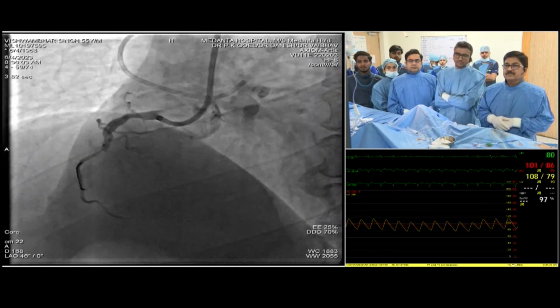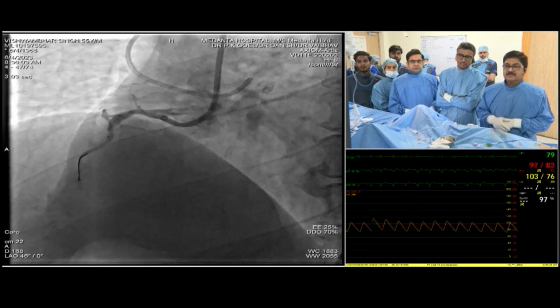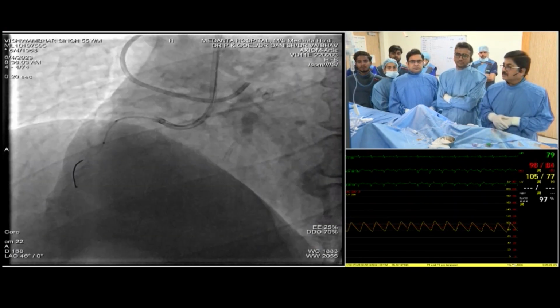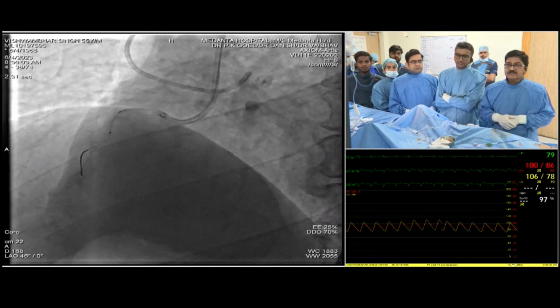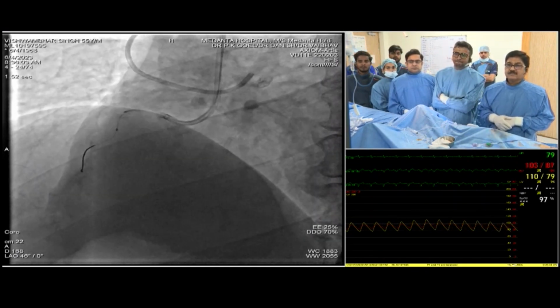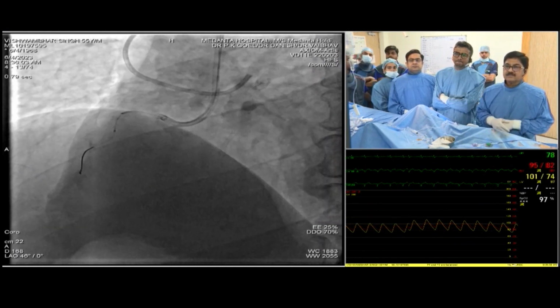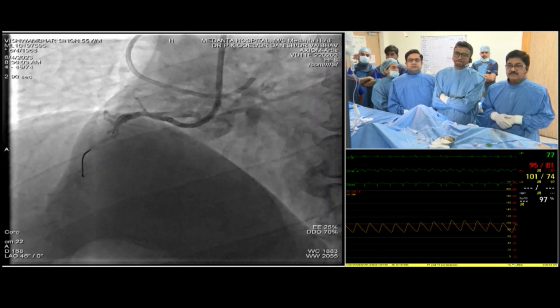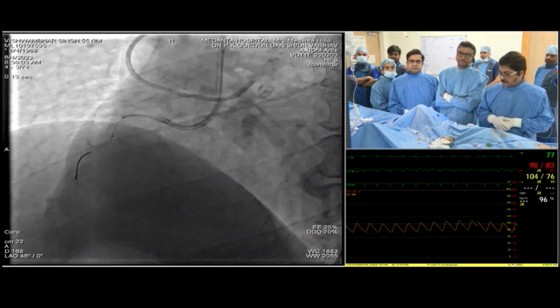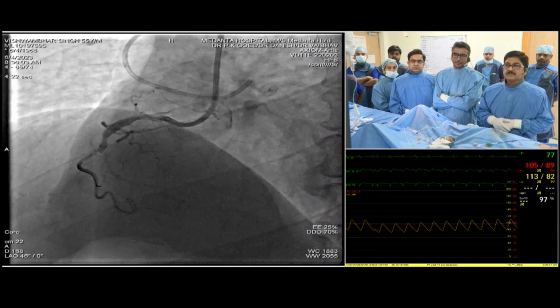Okay. And another confirmation system is IVUS. As you can see, this CTO lesion has a very nice RV branch in front of the CTO entry. So we can do insertion of IVUS. And I don't know where this vessel is in the CTO lesion, but we have the chance to pass through this channel. So you'll take an IVUS now.